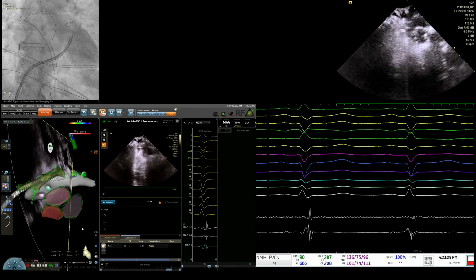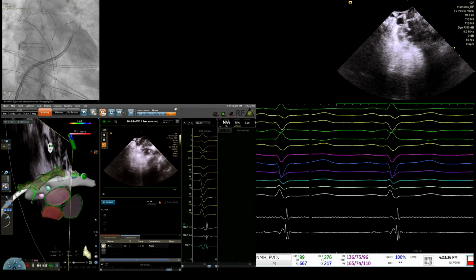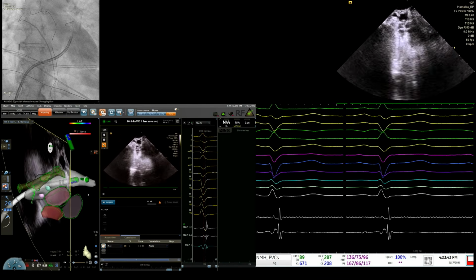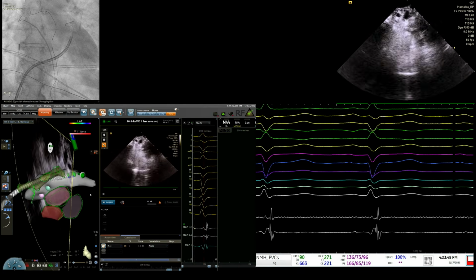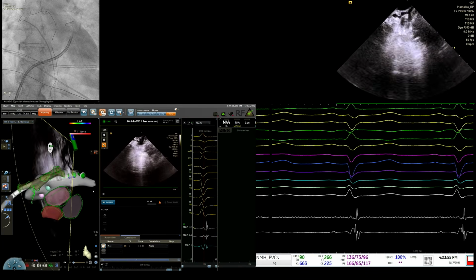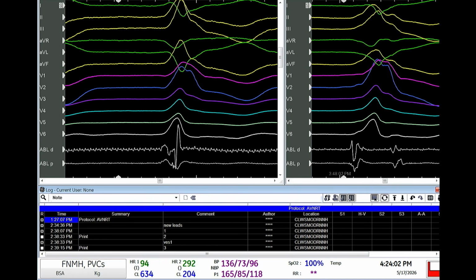Well, thank you. Nice presentation. So a couple of comments: we have a workflow for this situation, the left ventricular outflow tract. Anything that is left ventricular outflow tract, we follow the same scheme of things. Now, when you look at the 2 PVC morphologies, I don't know what screen you have there. Maybe, can they show just the EKGs? Like the review, but go up to only the 12-lead EKG.